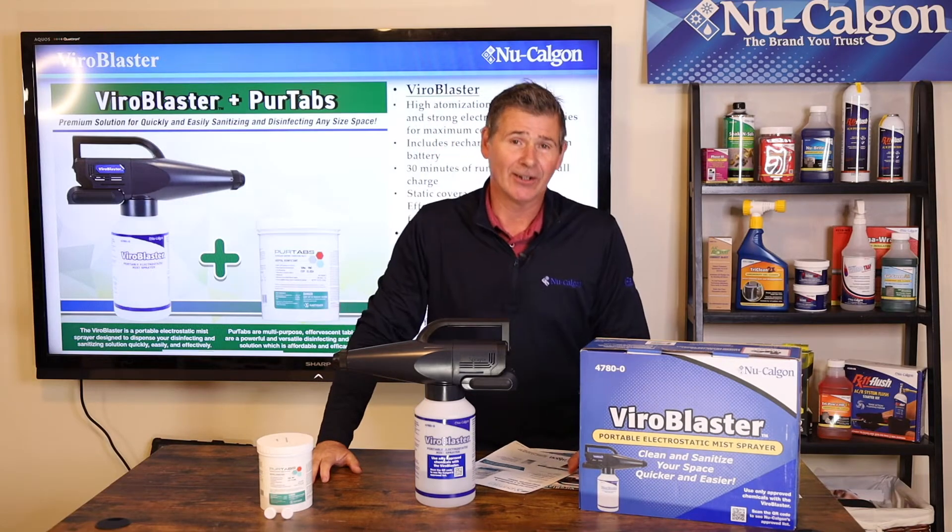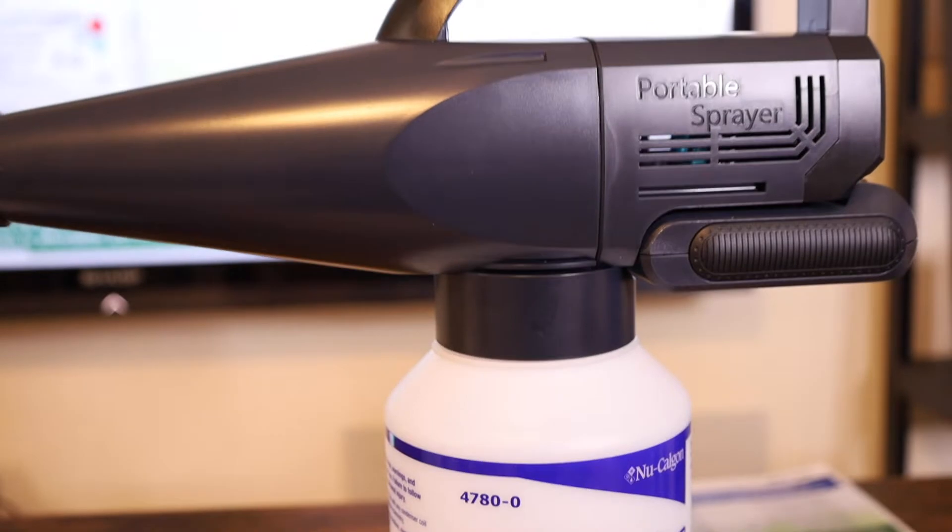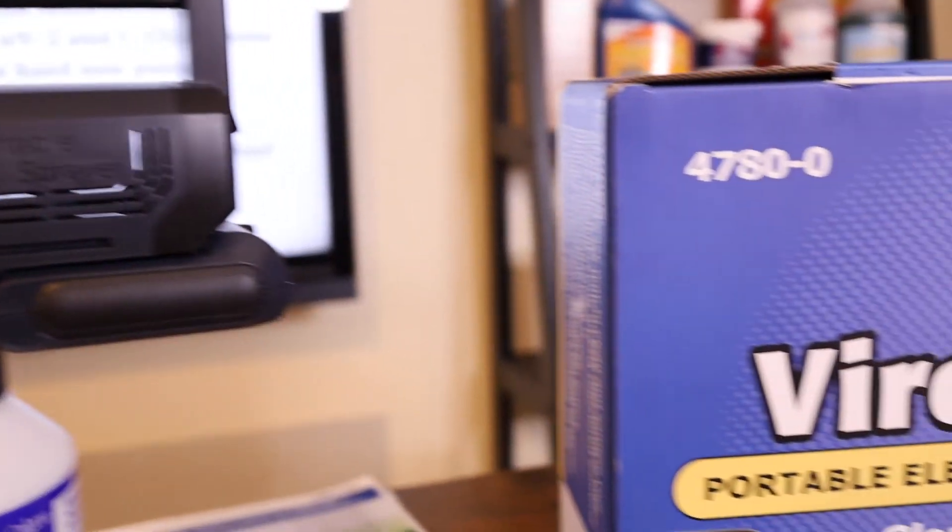Hey folks, Jim Dufault here for Nucalgon. In today's micro training class, I'm going to take you very briefly through our ViroBlaster, which is an electrostatic mist sprayer.